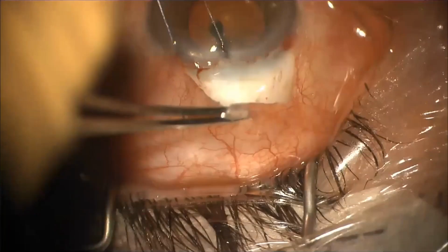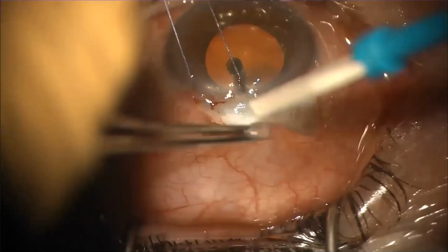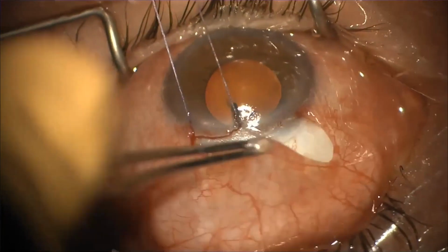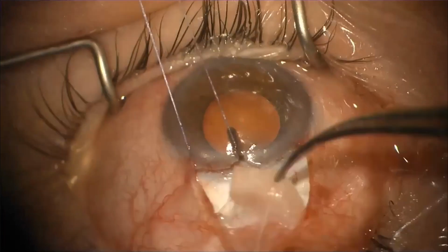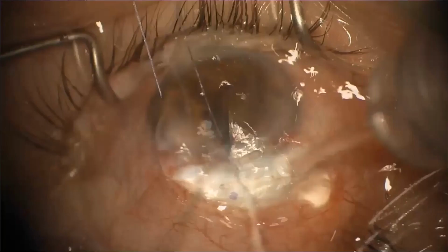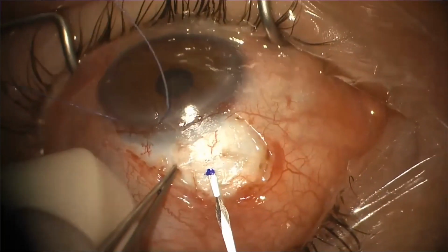Once all the pledgets are in, I sometimes take that last pledget and try to have it sit, as you see right here, kind of where the distal end of the device is going to come out of the sclera. Remove all the pledgets carefully, make sure you count them all, rinse with BSS. Now here's the track.